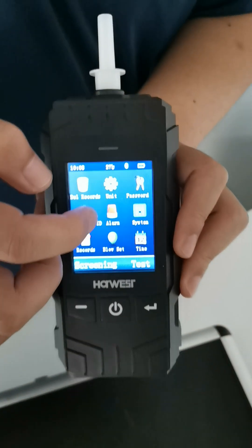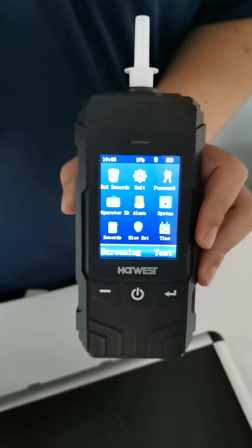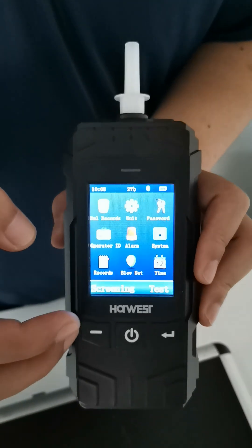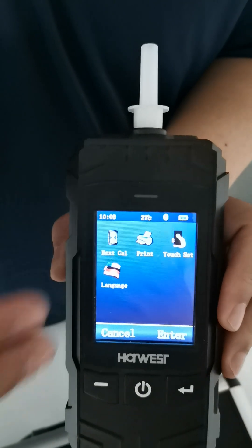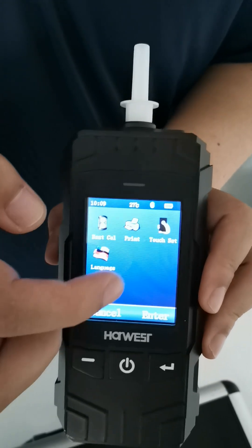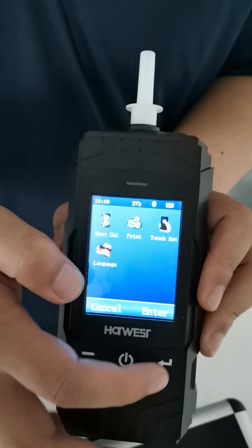Next one is alarm threshold — for different countries it can be set to different alarm levels as a reminder. Next one is system settings, where you can see the next calibration date, set the print options, set the touch settings, and also select the language.